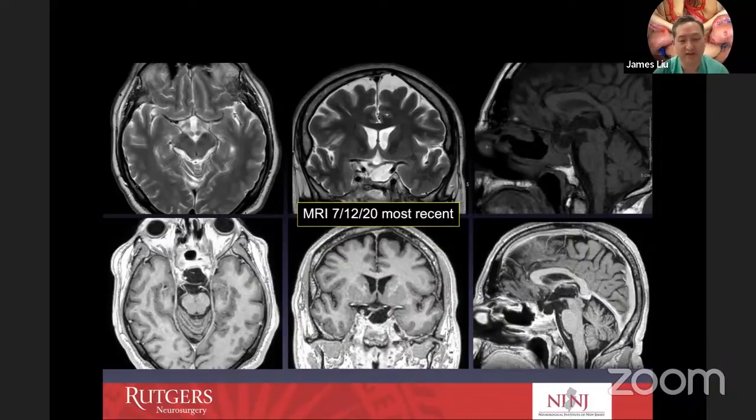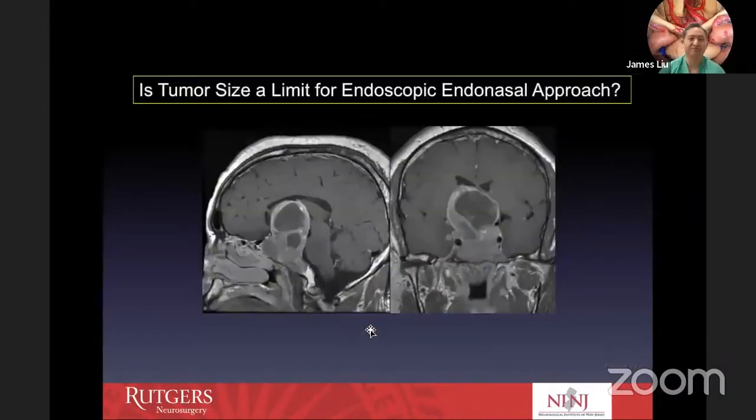I always look for the gland at every step of the way doing these surgeries. And our pituitary gland function preservation rate is 97%. In our series, only 3% require additional new pituitary hormone replacement. So we track every one of these patients and we monitor them post-op.